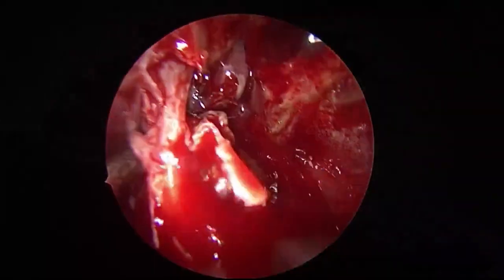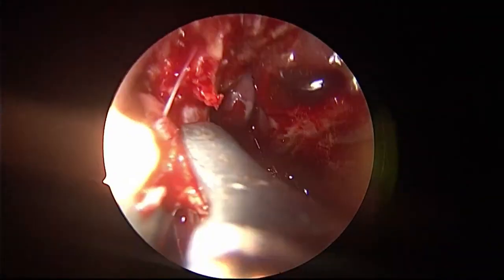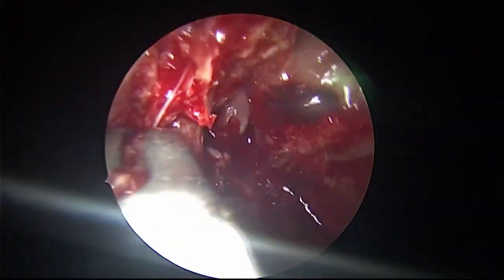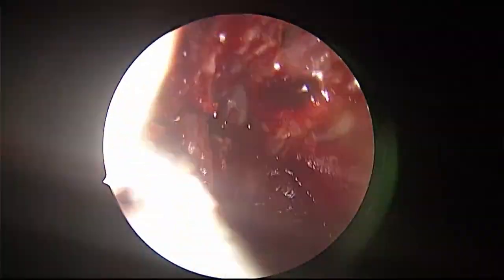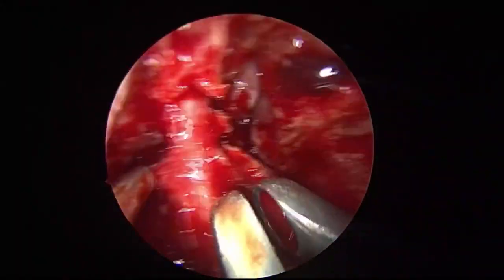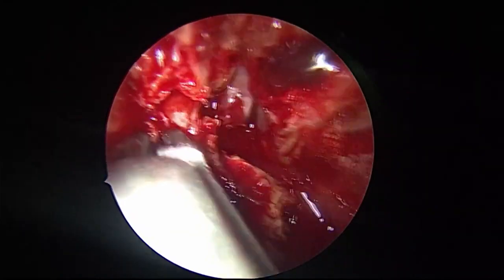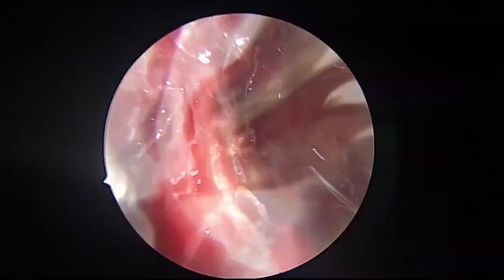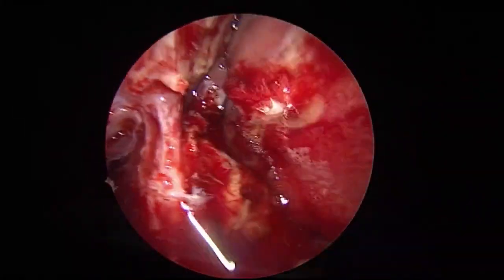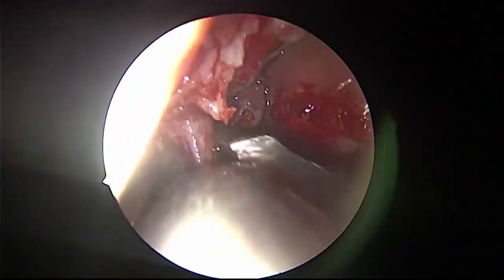Circumferentially removing the bone. See, the duct is standing out prominent. Important thing is to define the level so that it doesn't overhang. An overhanging duct can get fibrous, and then epiphora is the likely thing. See this duct at the level of the orbital floor.